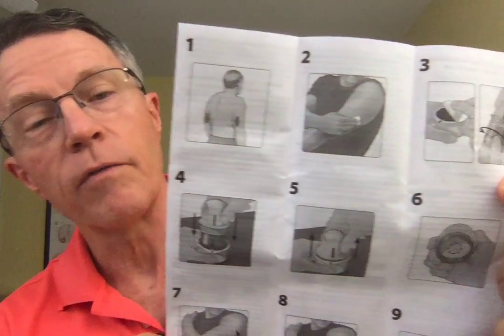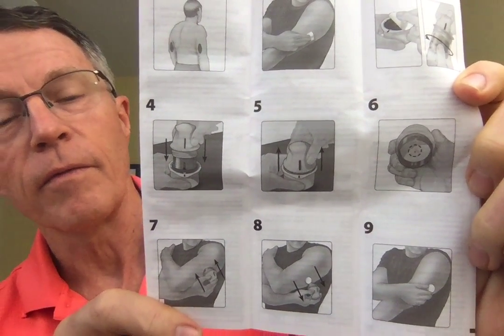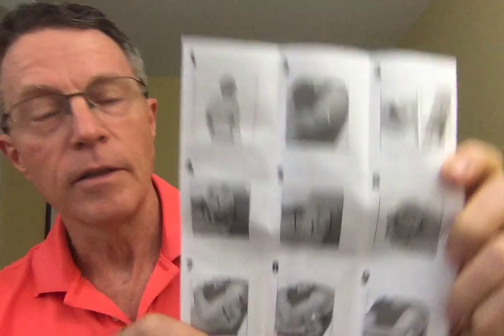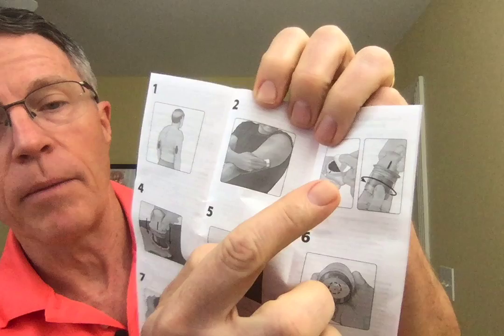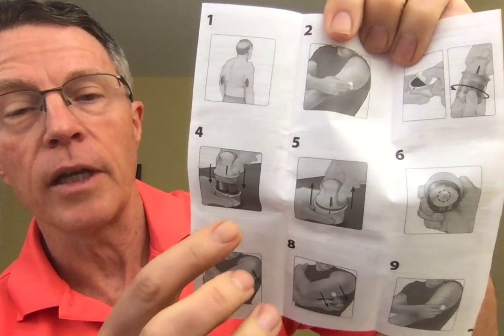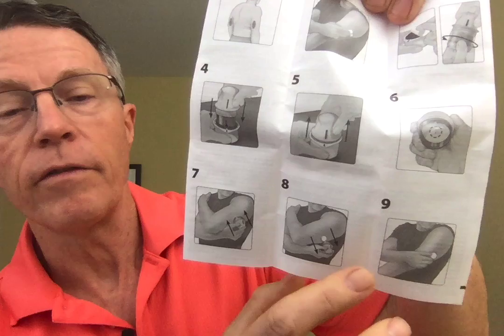I've already read the insert online but I'll go through a couple of basic points. They've got pictures, which are very good for somebody like me who likes to rush through and maybe not always read directions. This is showing where you usually put it, cleaning it, applying the sensor to the applicator — which we'll do in a minute — applying it, pushing down, holding it there, and then bringing it off and leaving the sensor on your arm.